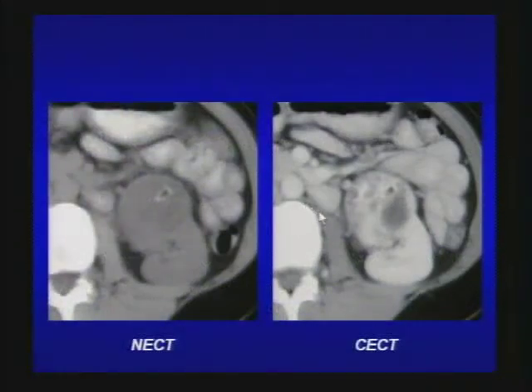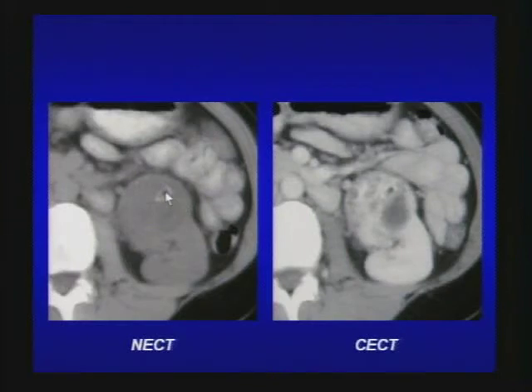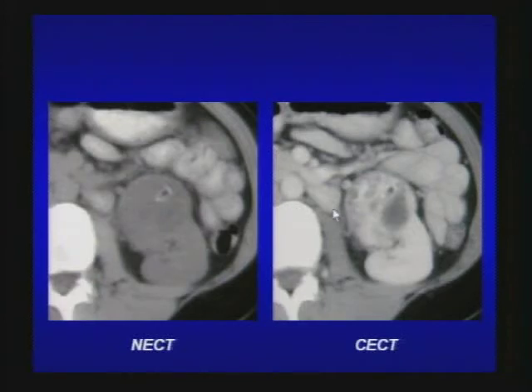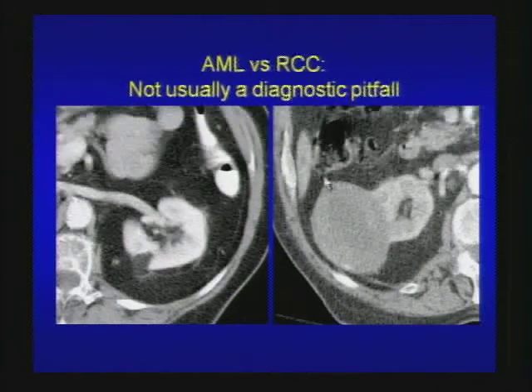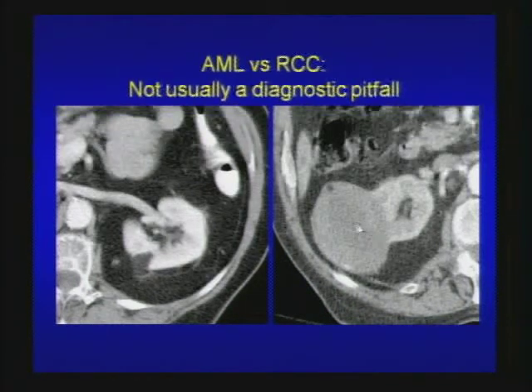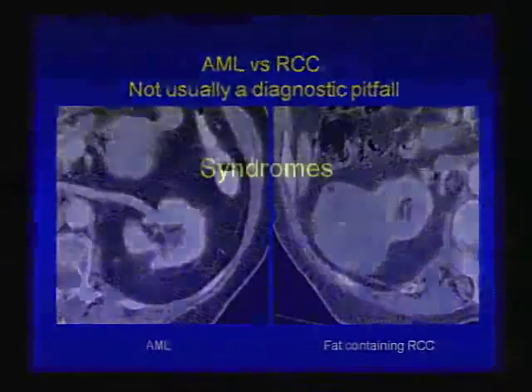Here's a case where you see a predominantly solid enhancing mass from the left kidney. On non-contrast CT there appears to be a spot of fat — and in fact it is fat, but this is not an AML. This is actually a fat-containing renal cell carcinoma, as sometimes RCC can entrap fat or it can result from osseous metaplasia. With this much solid component, you call this renal cell carcinoma. On your left, a predominantly fatty mass from the left kidney is AML; on your right, a predominantly solid mass with a little bit of fat is fat-containing RCC.